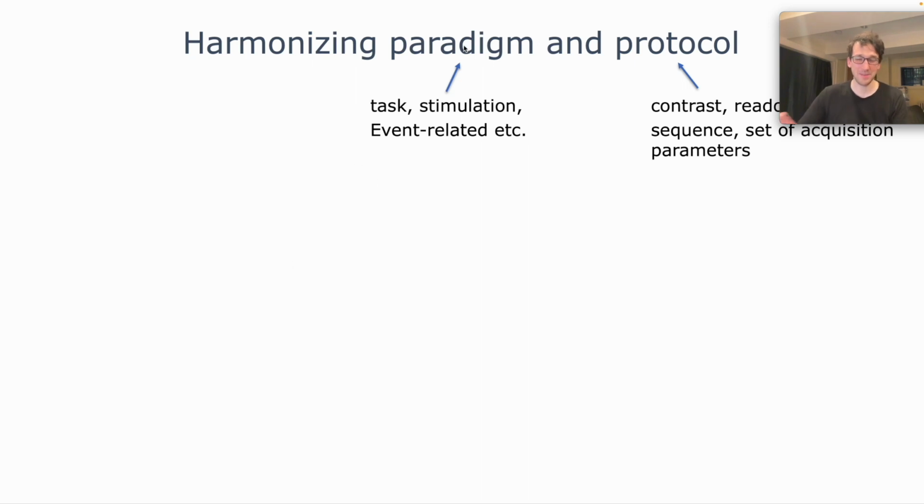And with paradigm, I basically mean the stimulation, the task, the timing, if you use events or blocks. And by protocol, I mean a specific set of sequence parameters like TR, your contrast, your readout, your specific acquisition parameters that I talked about.